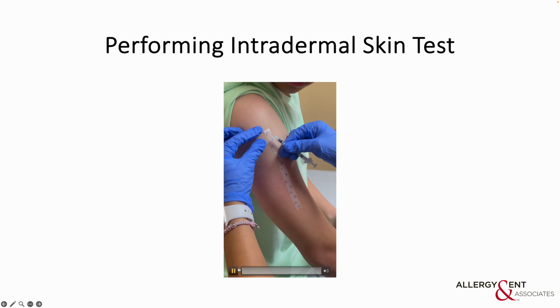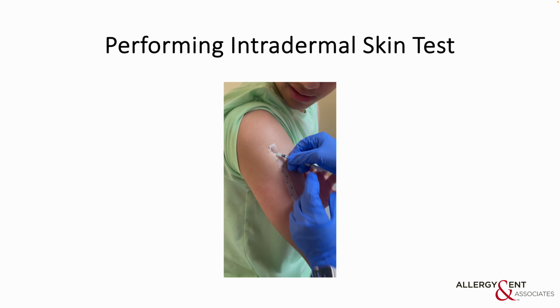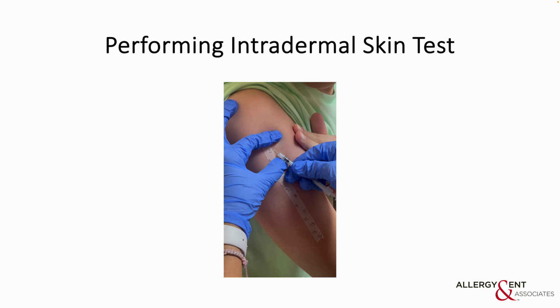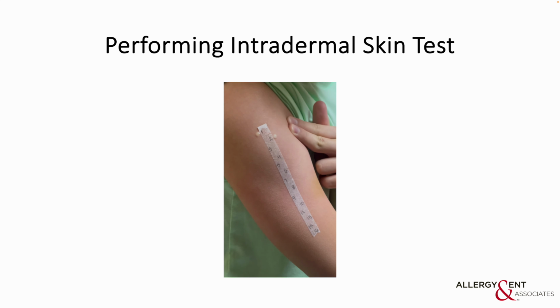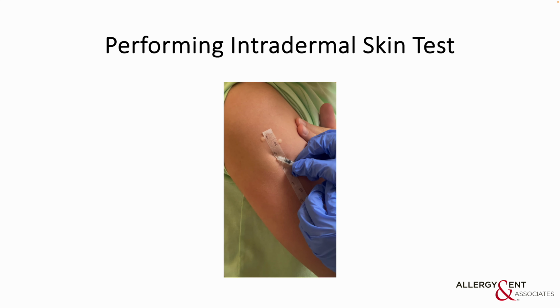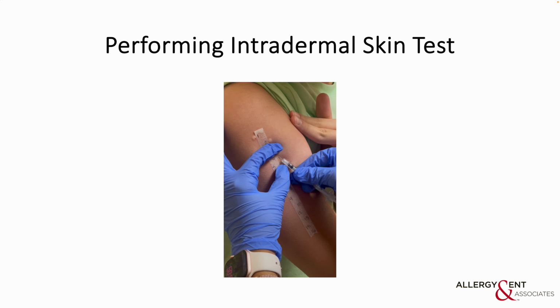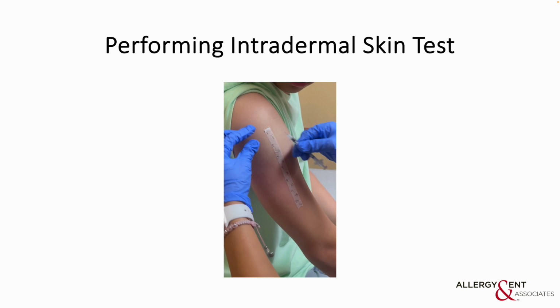Okay, so let's see how she does it. Okay, so it's pretty good.